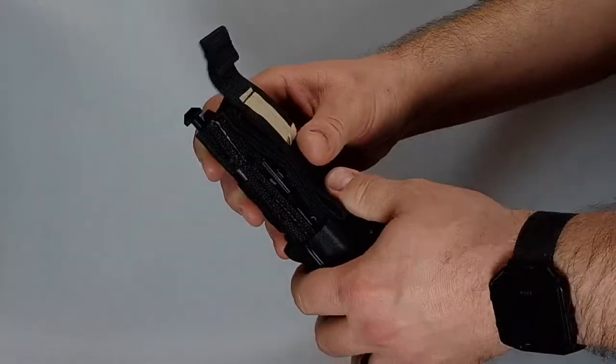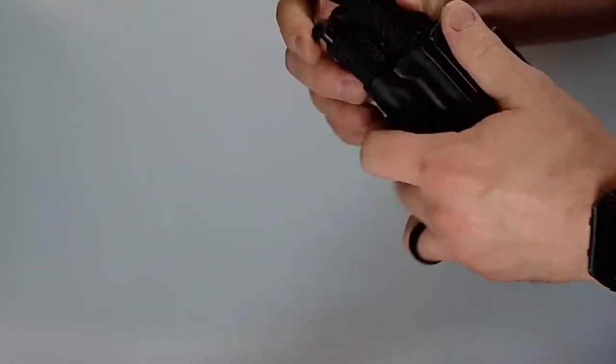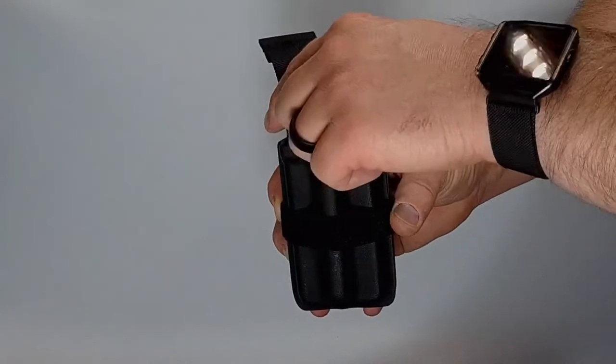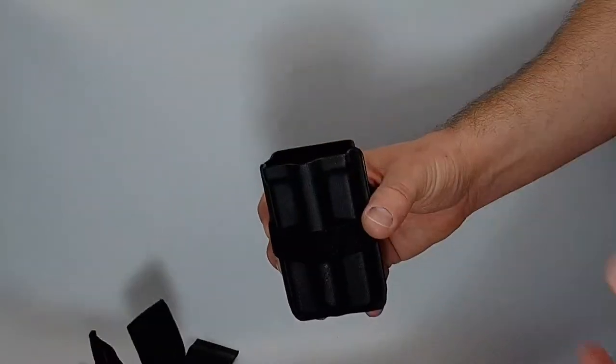There's nothing that is locking this in place other than the friction retention, so if you have to do this one-handed, and even if you have to use your teeth to get this out, it will come out just like that.